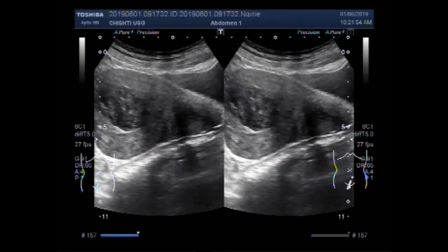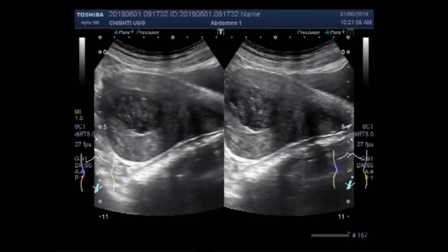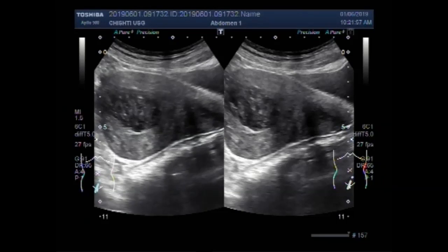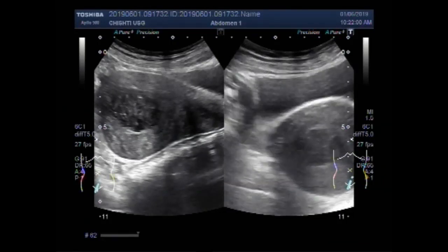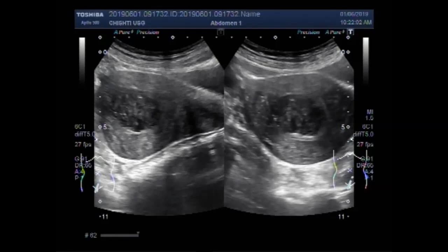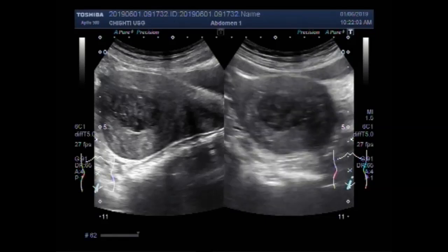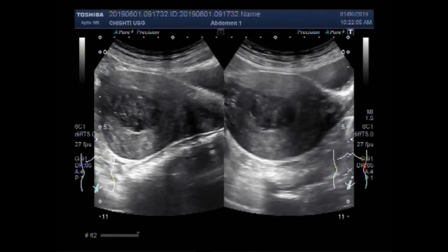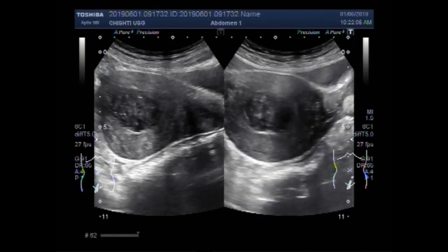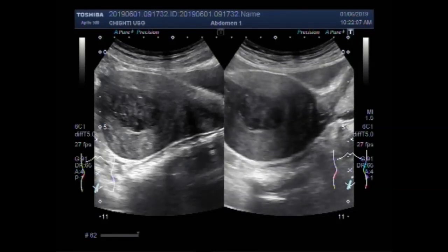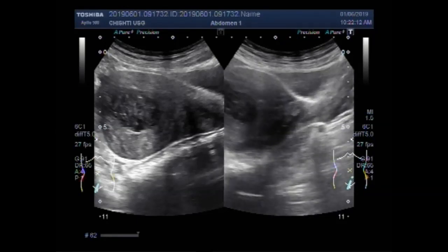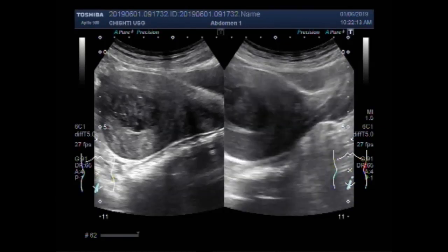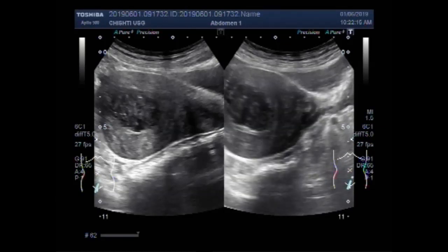The uterus looks bulky and enlarged. Again, you can see the view of the mass in the transverse position. You can also see the blood flow.